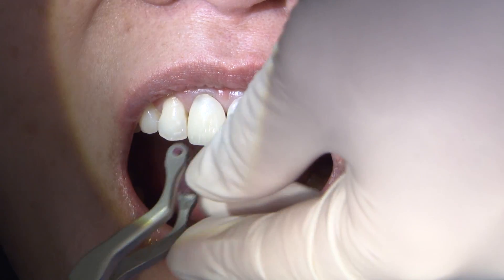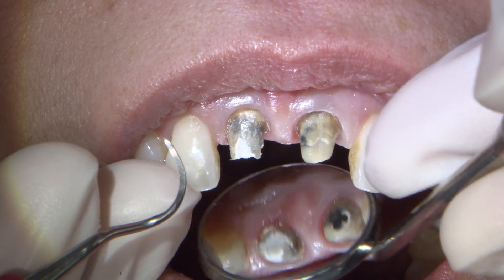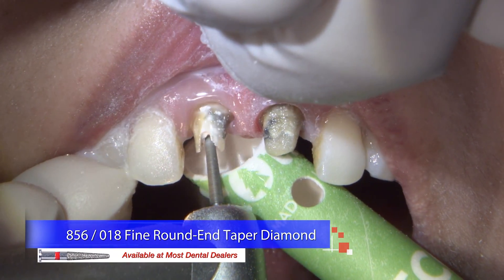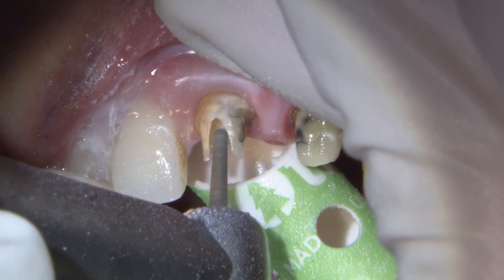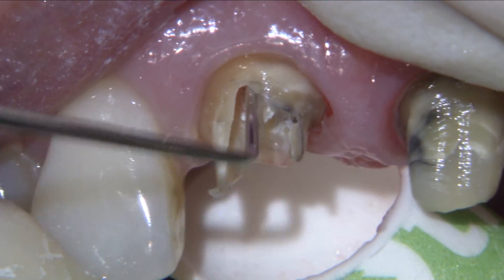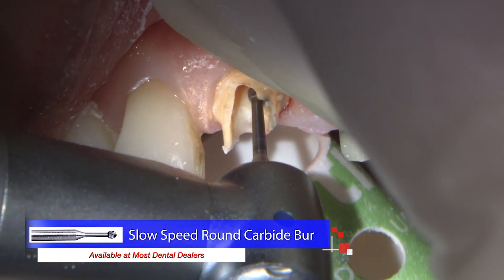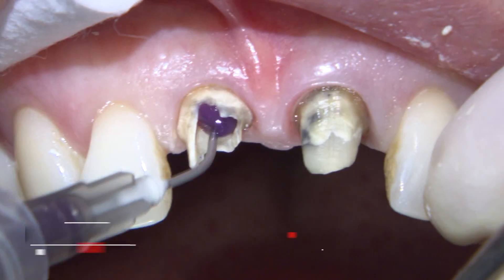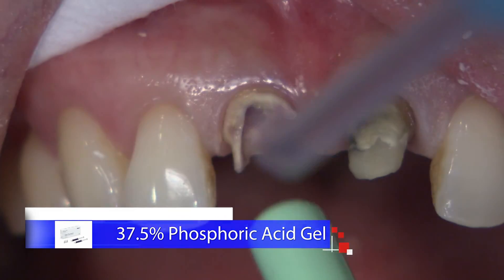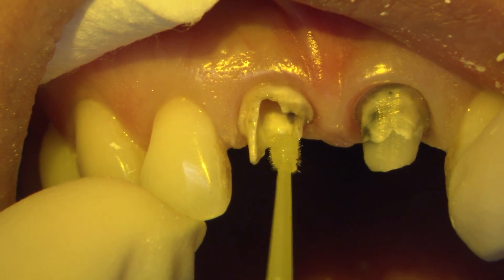Now on to our second appointment. The patient has received their endodontic retreatment and we will remove these Biotemps Now restorations and see what we need to do to finalize the preps. I'm using an 856-018 round end tapered diamond to remove the IRM from the access cavity on number 8, carefully making my way down to the protective barrier left by the endodontist. After I pop the cotton pellet out, I use a slow speed round carbide to gently remove any remaining IRM and sealer from the access channel. To prep for the fiber post, I'll etch the area with 37% phosphoric acid for 10 seconds, rinse and dry, and then scrub 3M's Scotch Bond Universal into the tooth structure, as I will bond the post with 3M's Adhesive Resin Cement Rely-X Ultimate.